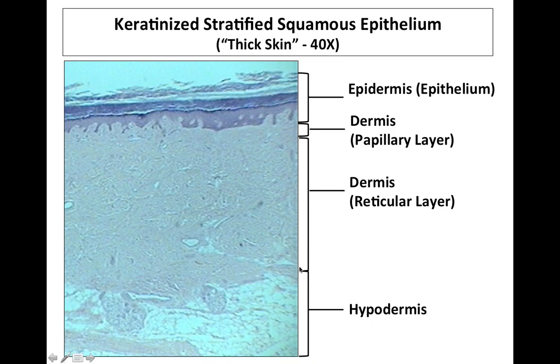So to begin with, you see a hypodermis at the very base here, made up mostly of adipose, a nice thick layer of the dermis divided into two layers, first reticular, then the papillary layer. Papillary layer is most notably named right here for the fact that it gives off finger-like projections called papilla. You can see those indenting their way here into the epidermis. And then, of course, you see the darker cells making up the epidermis.